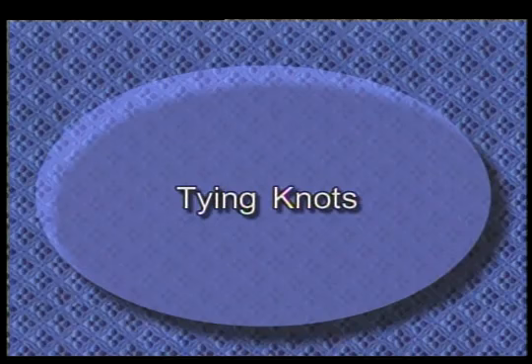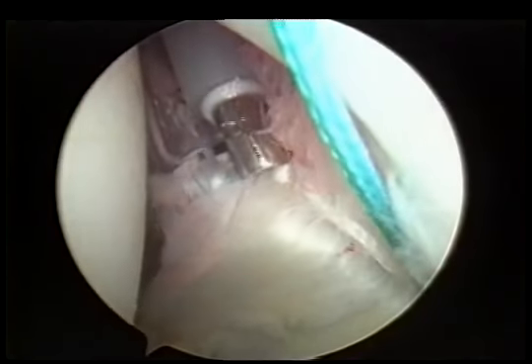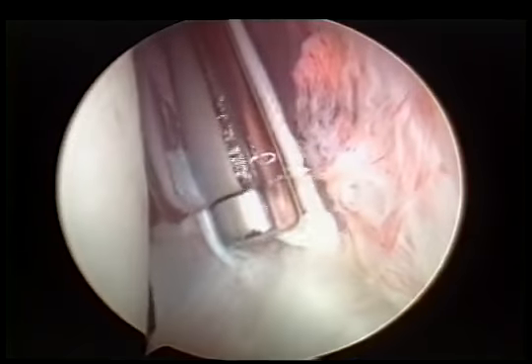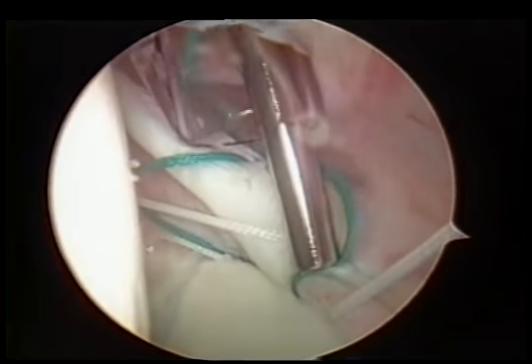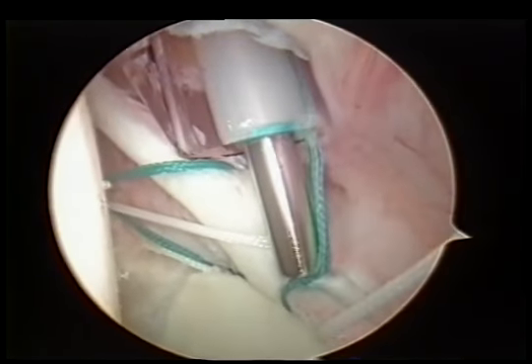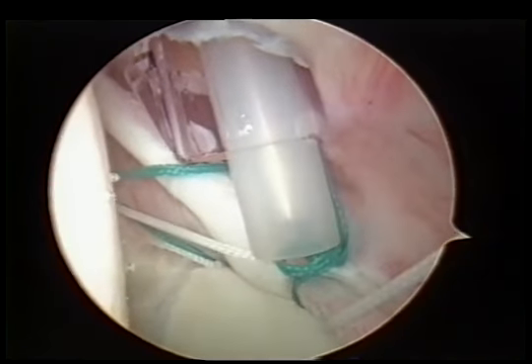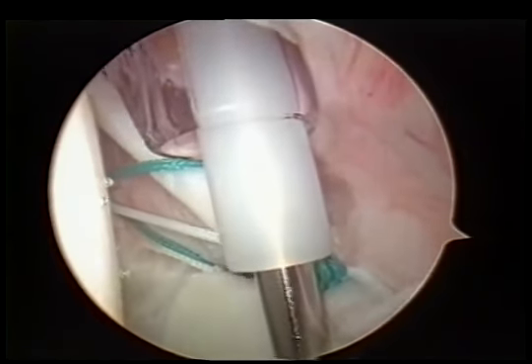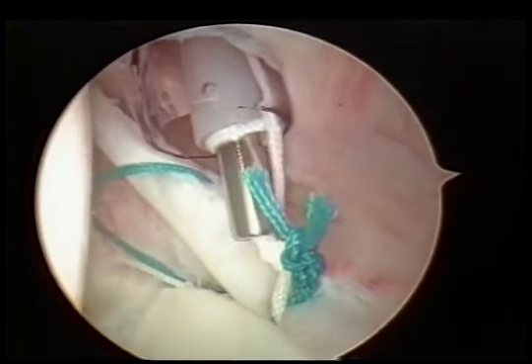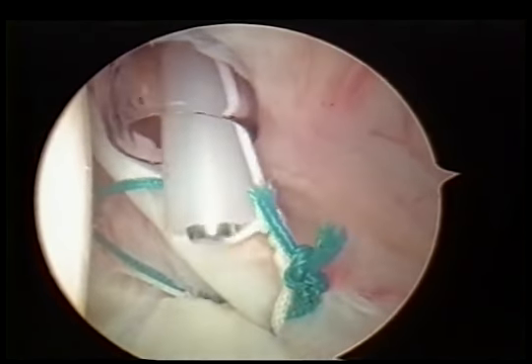Next we'll tie our knots. I like to use the 6th finger knot pusher because it holds a tight loop. It provides the maximum loop security as you're tying your knot. Alternatively, you can use a sliding knot and stack half hitches on top of that. The most secure knot is going to be one that has your base knot with 3 half hitches stacked on top of that.